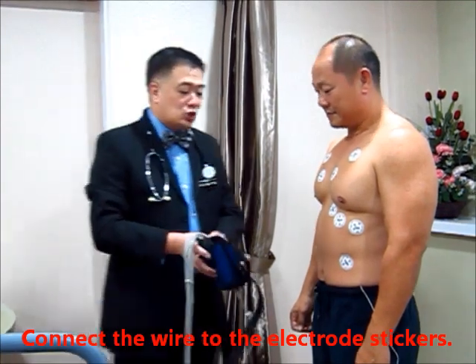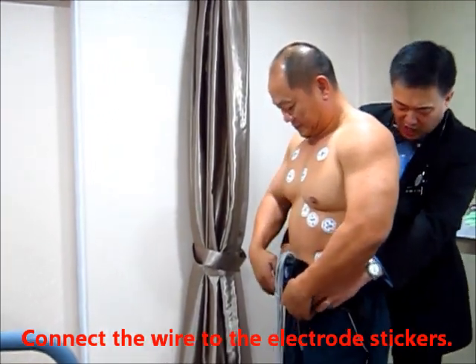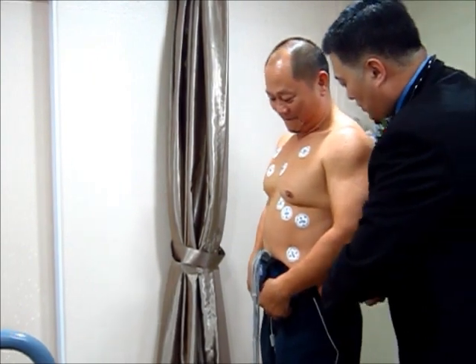The next thing I have to do is put this ECG monitor and strap it around the patient's waist. Mr. Koh, your waist is about how many inches? 33 inches. Wow, I'm 38 — you're 33, I really envy you with that body.